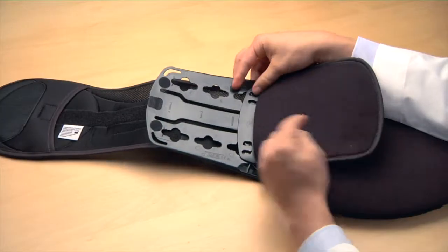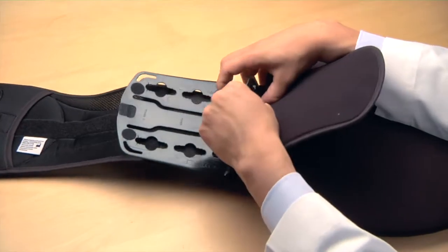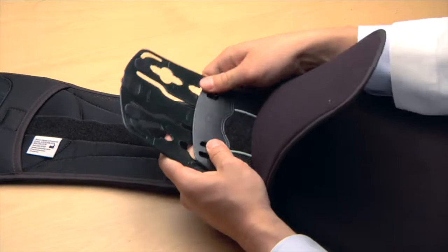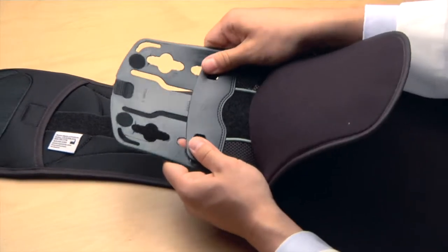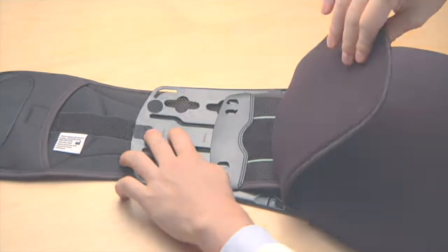All adjustable Summit braces come pre-configured in the medium setting. For smaller sizes, slide the plastic rivets out from the medium sure slot opening, reposition them in the appropriate setting, and pull to lock in place.